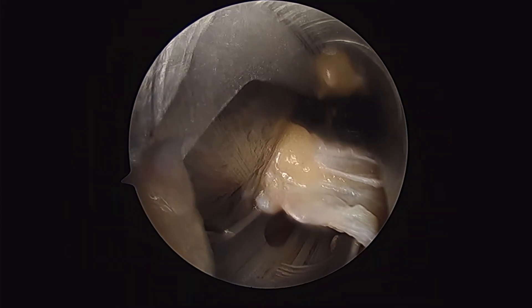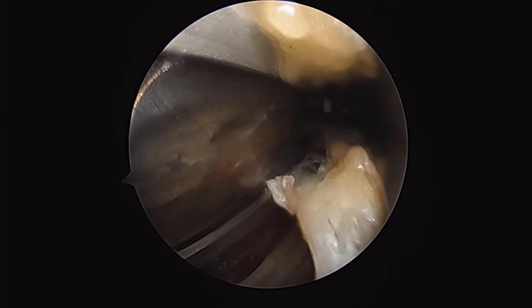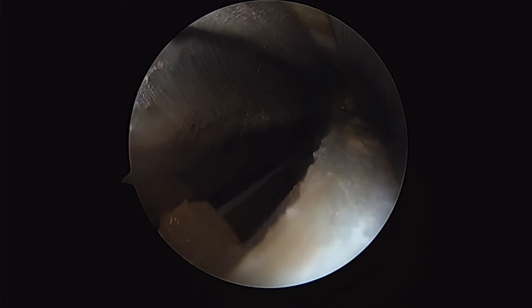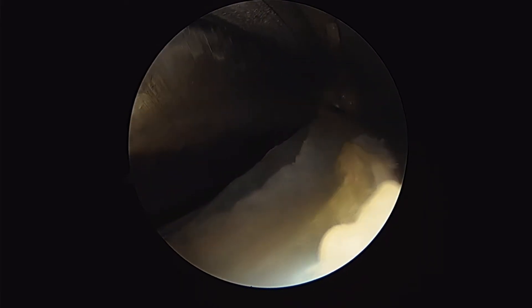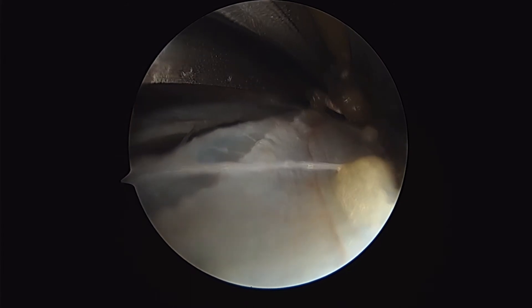So you can see here, we're doing our antegrade knife, pushing through the fascia. There's no tension on the fascia in terms of a Kocher. I just have the guide assembled and slid over the fascia itself. You can see as the knife goes through, I'm able to get an excellent release.